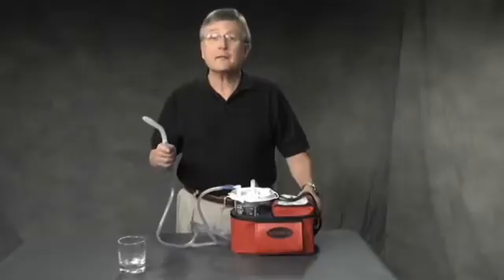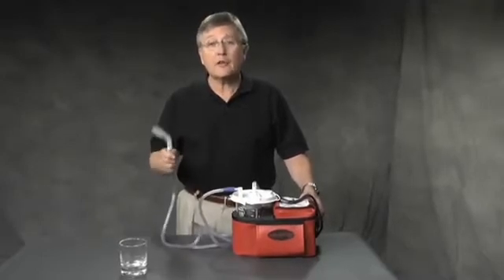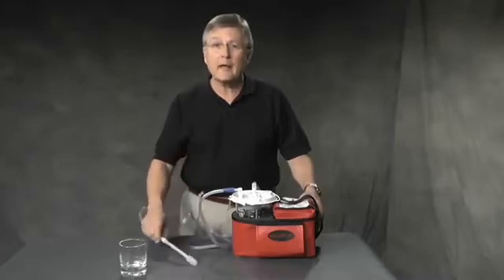The Escort 3 is powerful, pulling more than 30 liters per minute airflow and generating in excess of 525 millimeters of mercury negative pressure.